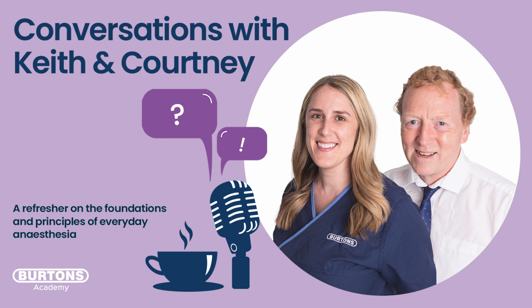So this is the nature of these podcasts, that things come to mind and you just kind of need to, if I don't say it now, I'll forget about it. I won't talk about it. So just to clarify, a pulse ox will determine the level of oxygenation, the level of saturation.